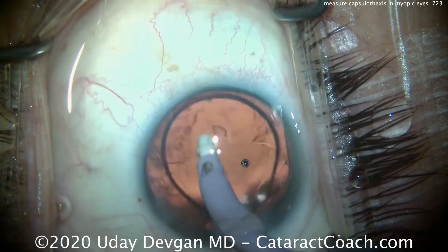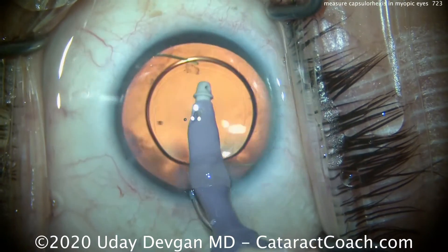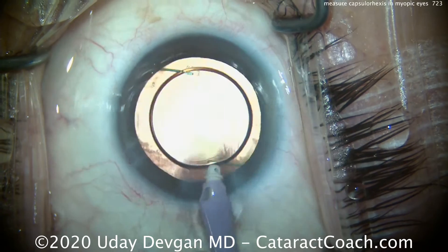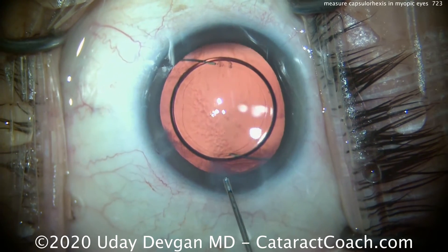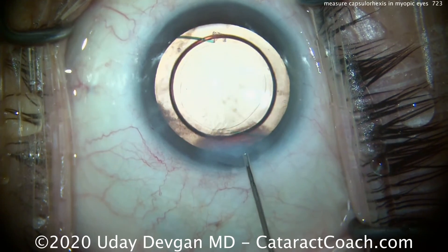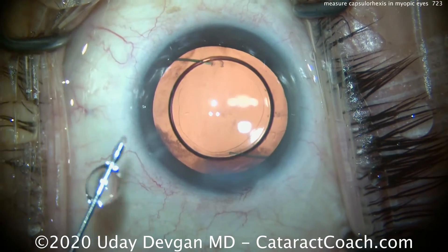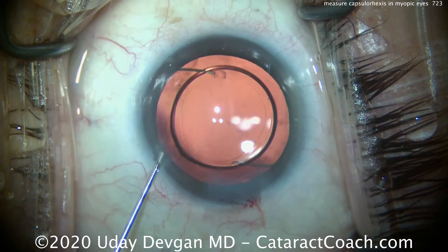In this patient, we were aiming for a post-op goal of about minus 2 diopters per the patient's request. As someone who has a slight bit of myopia myself, I can tell you that is a blessing — you get a wide range of near and intermediate vision. Now you can see the capsulorhexis edge overlapping the optic very nicely, beautifully centered. We seal up our incision and notice how we don't let the anterior chamber collapse during the case. The incisions are very well constructed, and when we come out of the eye with the phaco handpiece, we keep the anterior chamber formed. That barotrauma may put the patient at higher risk for retinal detachment, so we want to avoid that. A little angle sweep to remove viscoelastic, and we're done.